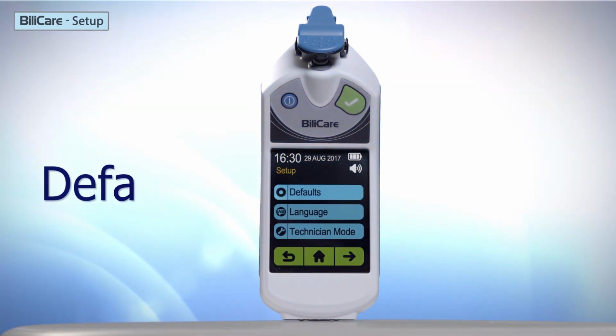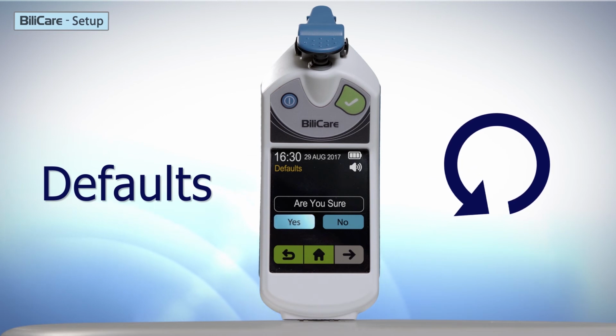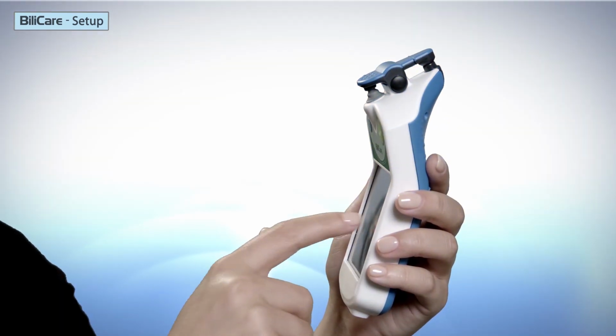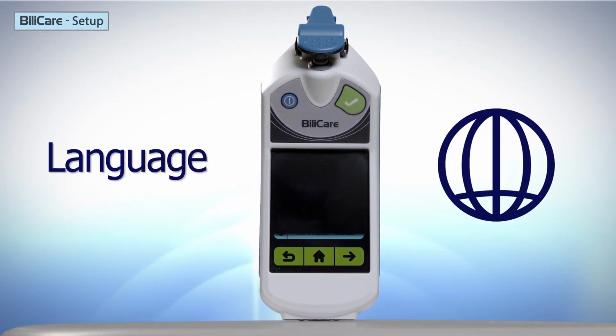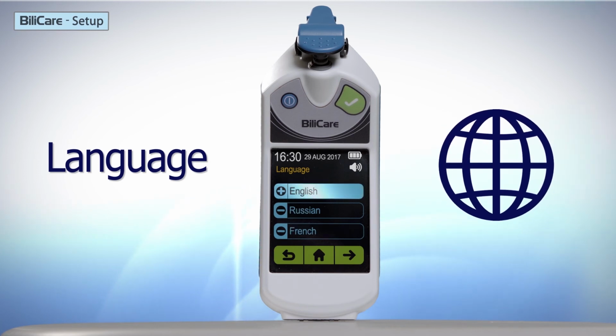The default menu restores BiliCare to the manufacturing defaults. Yes will restore the manufacturing defaults, while No will exit the menu without changing the current BiliCare settings. The language menu determines in which language the screens of BiliCare will be displayed. The default language is English.